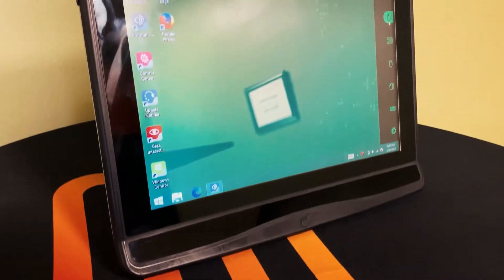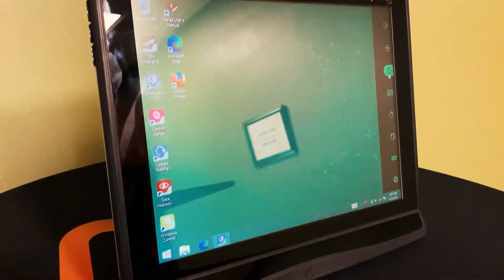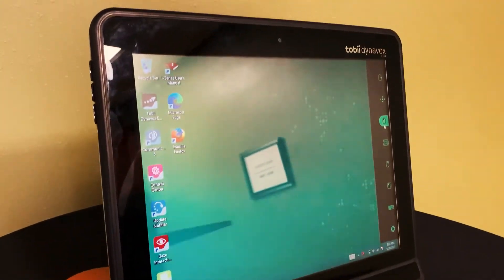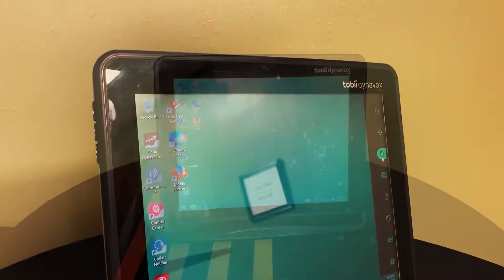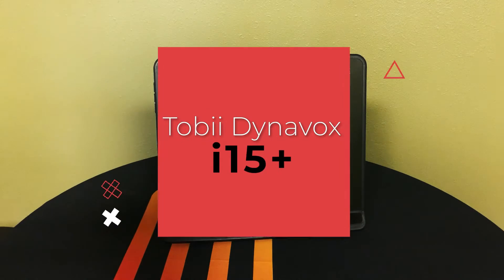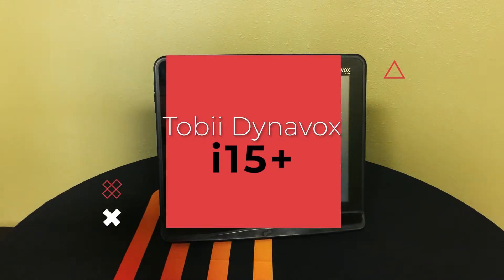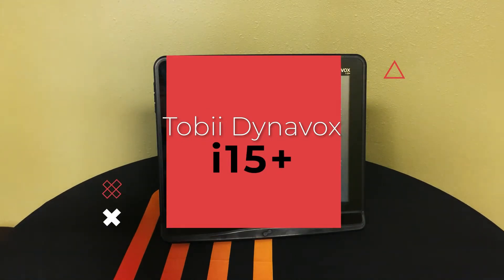What's going on guys? Today we're going to take a look at the Tobii Dynavox i-15 computer and AAC device.